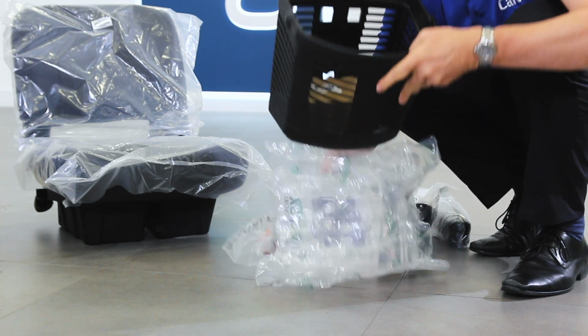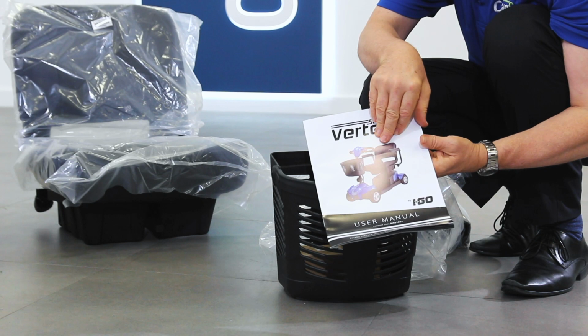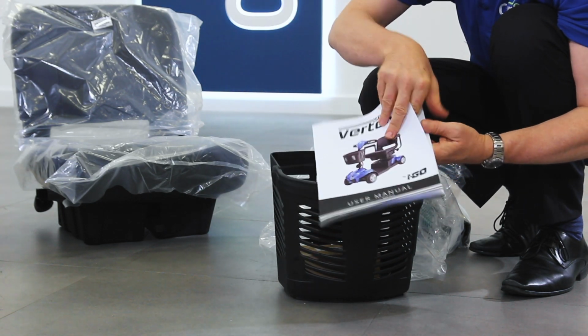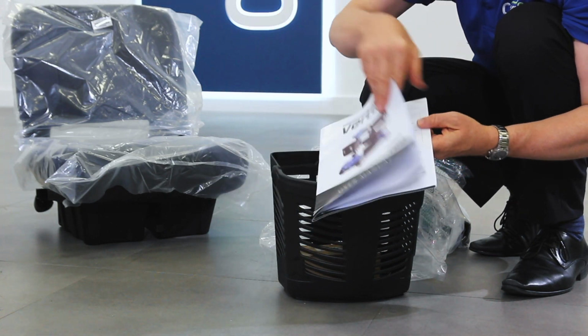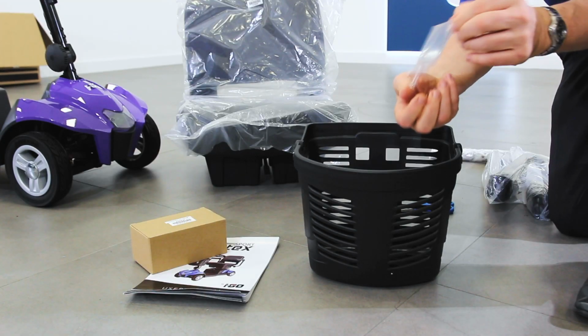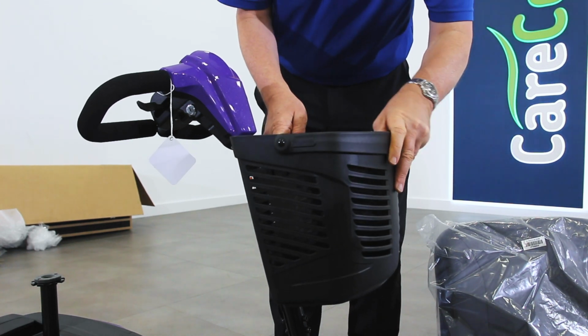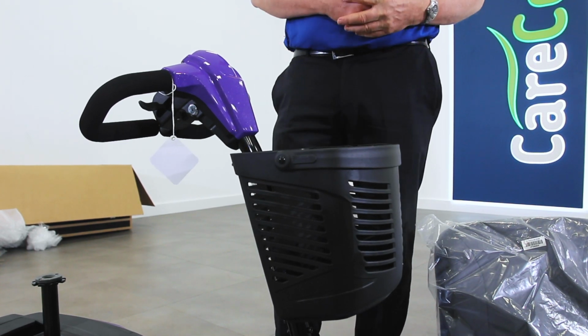Packaged with your front basket, you'll find the user manual. Please keep hold of this as it contains vital information regarding the use and basic maintenance of your scooter. You'll also find a charger for the scooter battery and an ignition key. The front basket can be attached to the tiller by slipping it over the designated grooves.